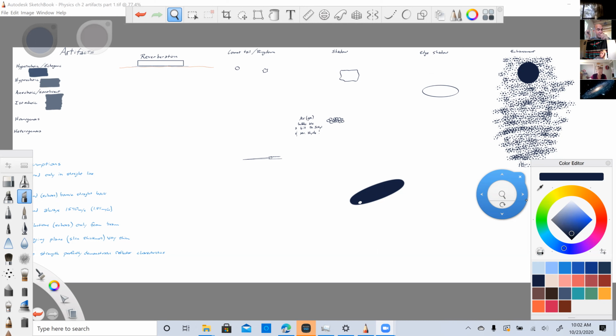Those all happen. And causes of artifacts. Number one, violation of assumptions. We'll talk about assumptions in a second. Equipment malfunction, of course. Physics of ultrasound, of course. And operator error. No, that would never happen. We never have operator error.